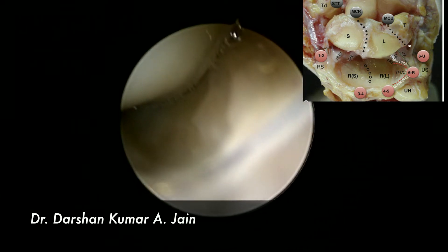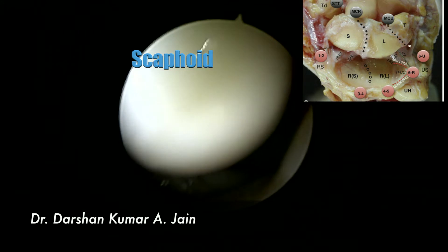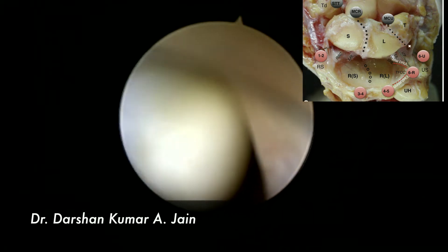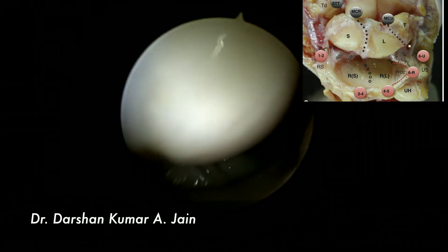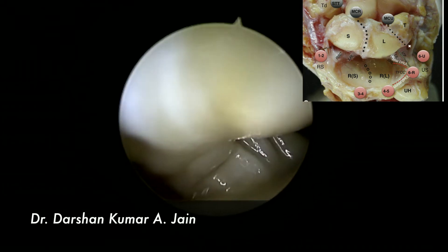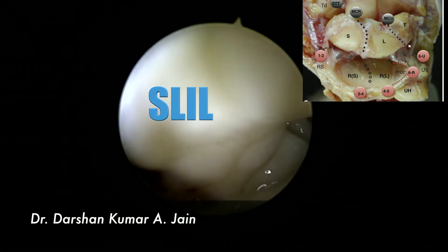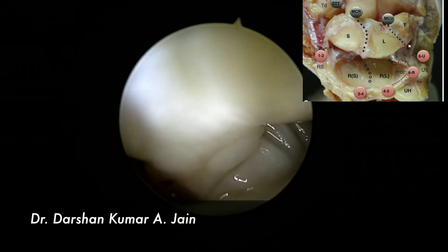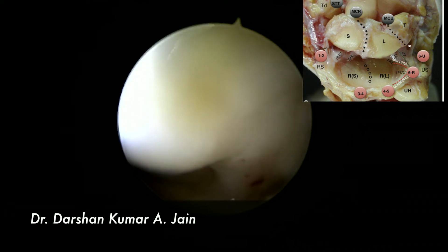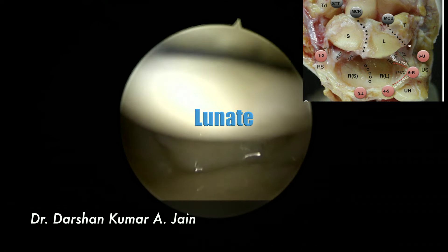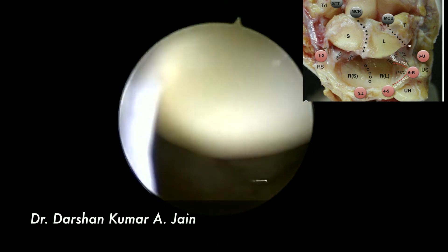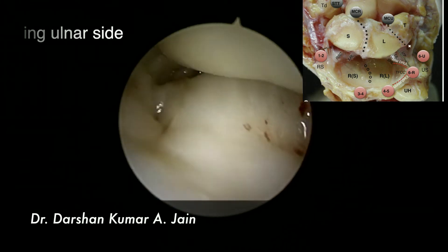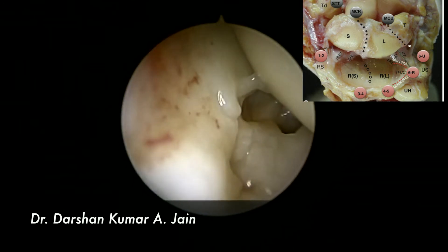You can see the proximal pole of the scaphoid, tracing towards the radial side further. That's the scaphoid-lunate interosseous ligament on the ulnar side of the scaphoid. That's the lunate. Going on the ulnar side, you could identify the dorsal attachment of the TFCC towards the capsule.